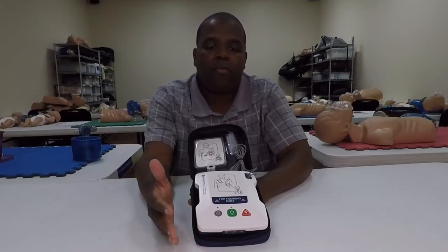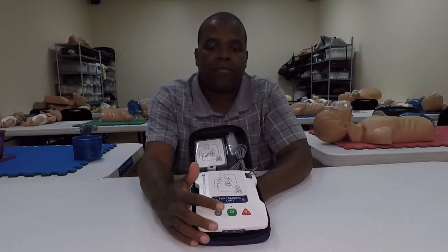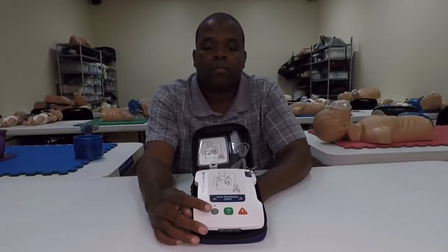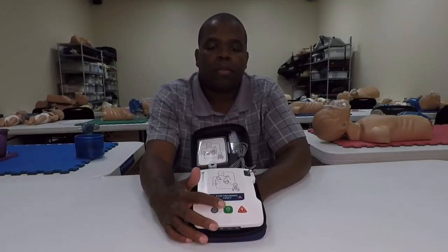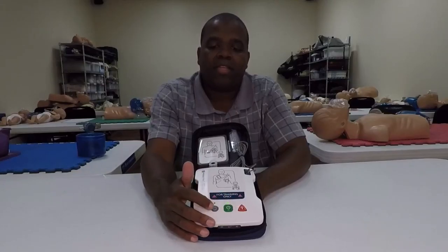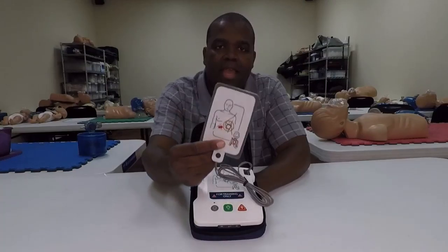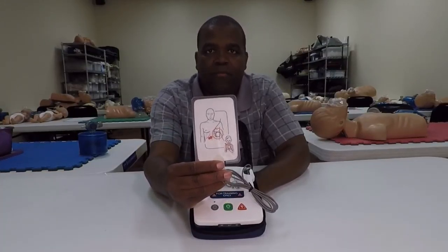That extra button saves you the trouble of going back and forth between child or adult training — you won't have to connect different pads. So if I want to go from adult to child, I don't have to reconnect any pads. I can just hit the button and it makes it a child training device.